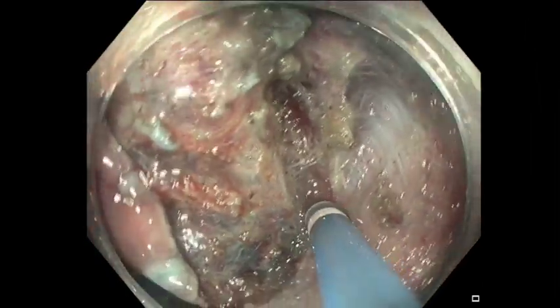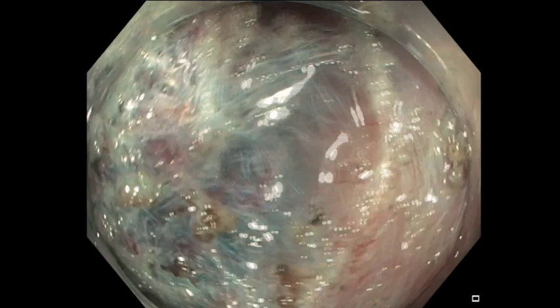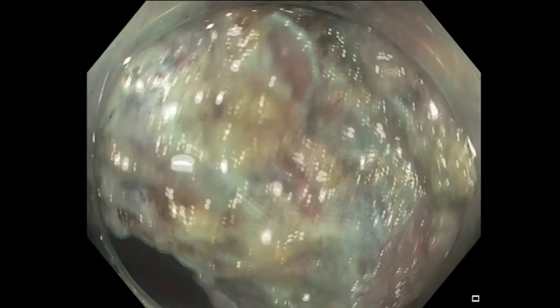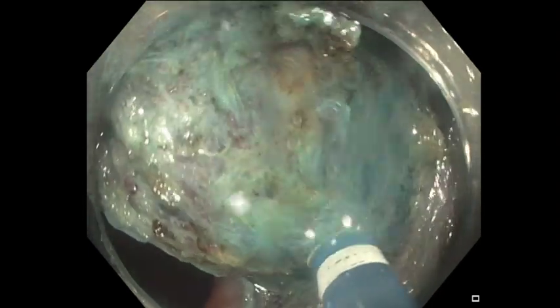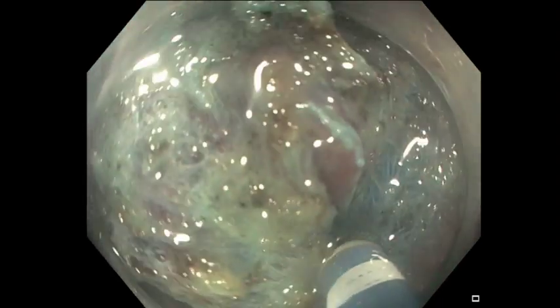So now once I dissected further, we used another 2 taps and then the bleeding stopped. This trick works more in colonic ESD, particularly right side colonic ESD. It may not work in the stomach because the stomach blood vessel is larger, so be careful about that. And now we can retract the lesion all the way from the left side to the right side. This is the final cut, and we can see here we identified the margin which we dissected initially.